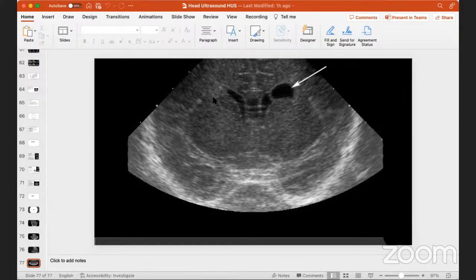And you compromise with the depth, as you have mentioned. By the time you reach the fourth ventricle and the lower part of the cerebellum, those views are not available because the probe frequency does not reach there. But if you use the high frequency, it gives you a better picture of the brain and also the ventricles.